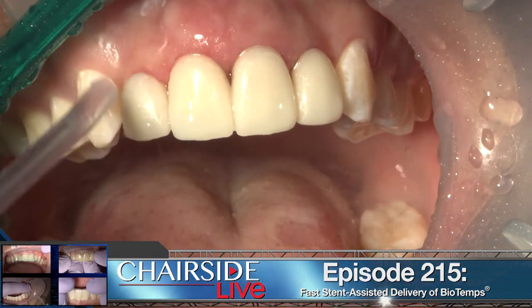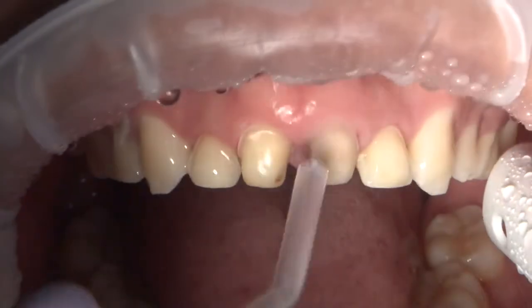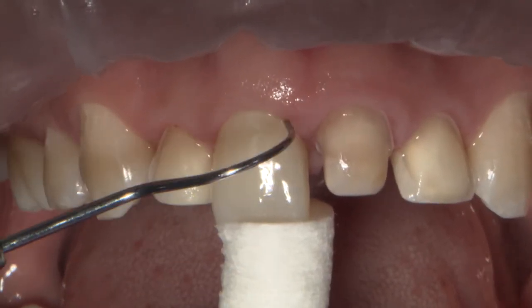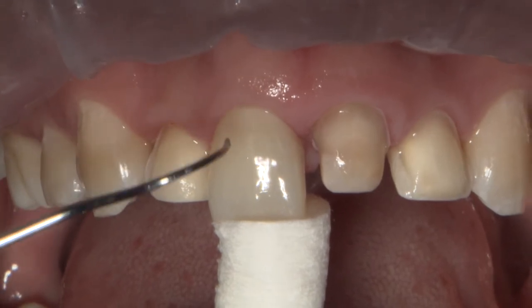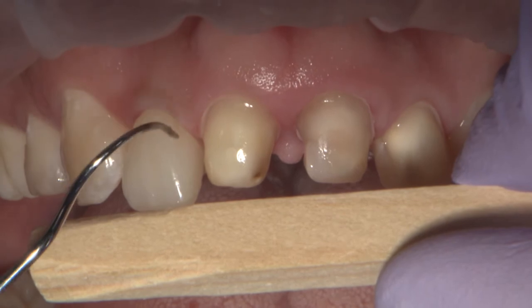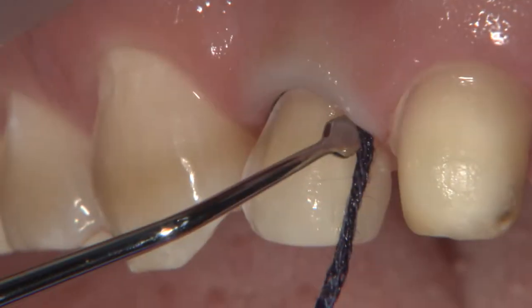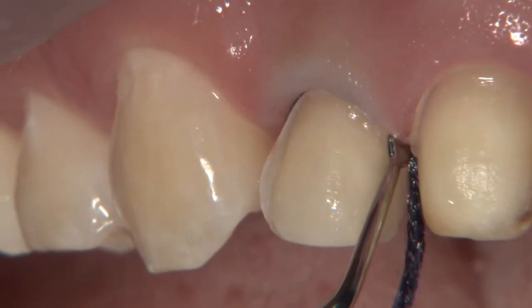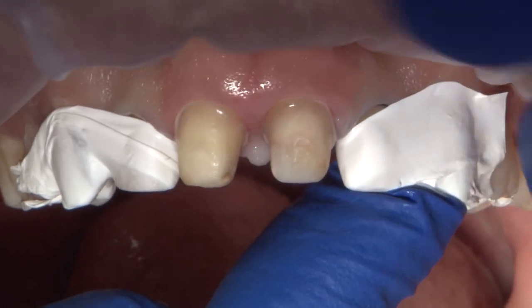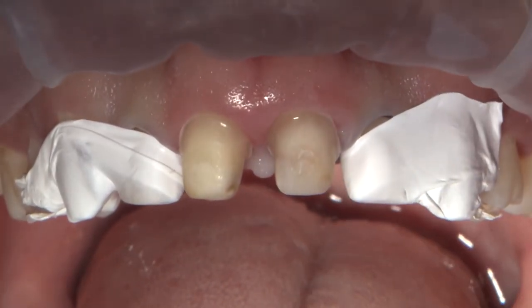For more information on how to expedite your temporization process, watch last week's episode on Chairside Live. At the final appointment, the four-unit Bruxer anterior crown and veneer restorations were checked individually to ensure proper fitting. Slight bleeding was observed on number 7, and to prevent any contamination during bonding, I chose to pack cord around the laterals before the veneer will be seated. Because the 8 and 9 crowns are to be delivered first, I prevent any excess material from adhering to the adjacent teeth by using Teflon tape.